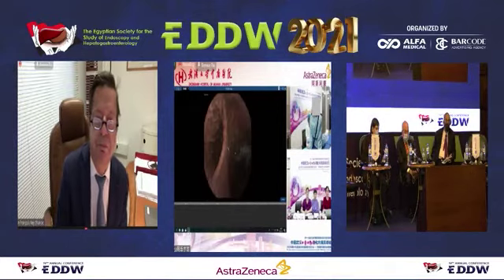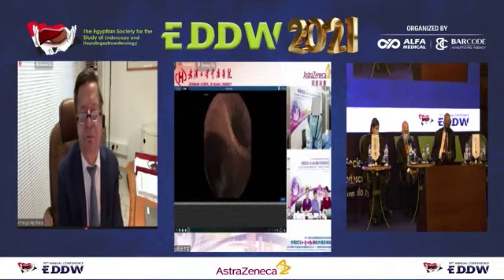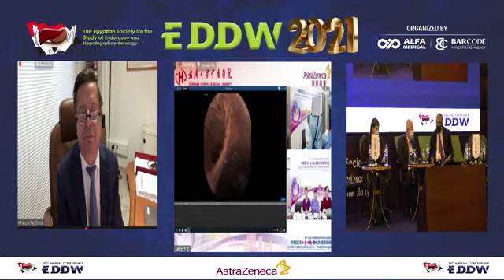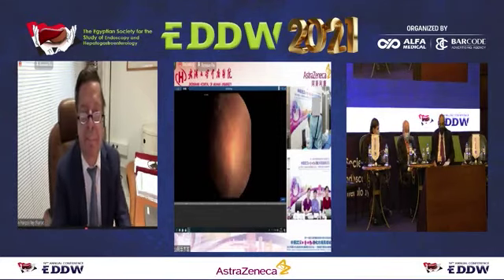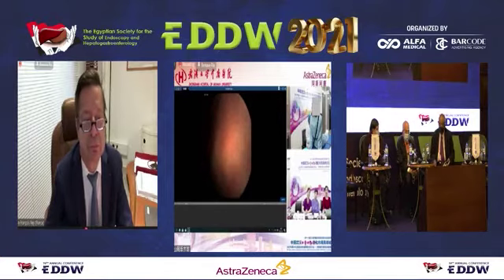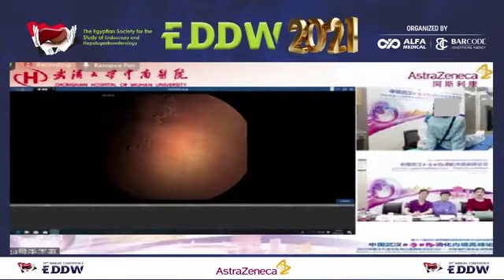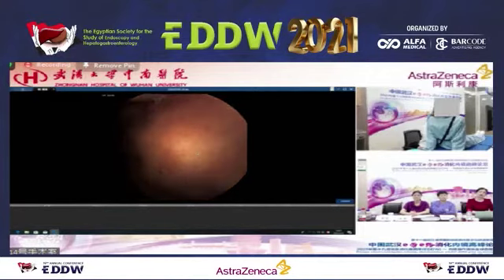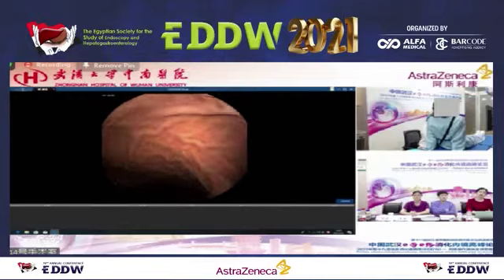Could you show us where the magnet is? Just now was the far view of the stomach, and now Dr. Zhou will show us the near view.